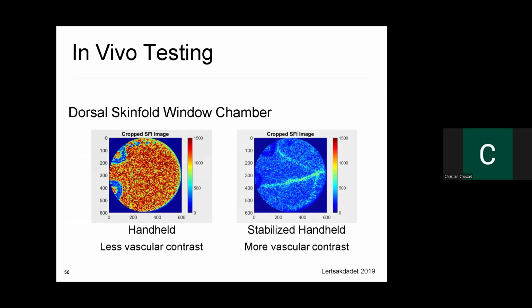So for this system, it was just to collect the data, but we did have the tablet basically right next to the system. It just wasn't being held onto the device. So it just made it lighter overall because it was just holding the stabilizer now instead of holding the tablet and the laser and camera and all the other components as well.